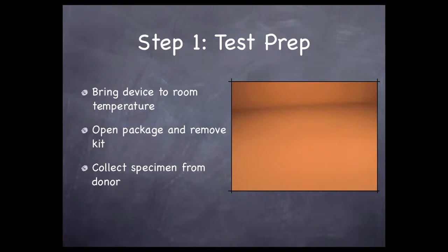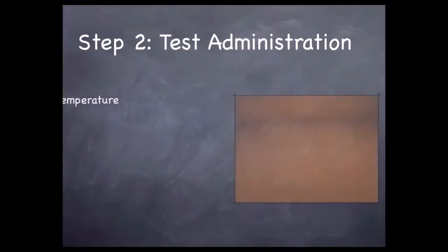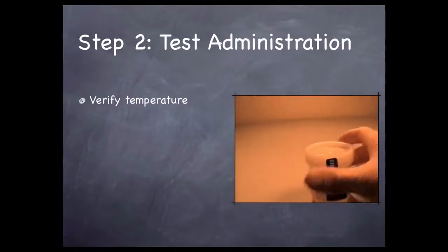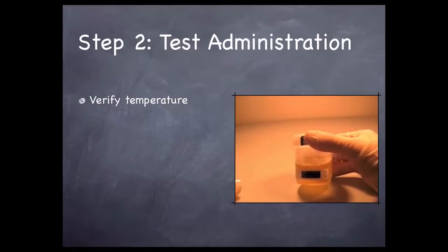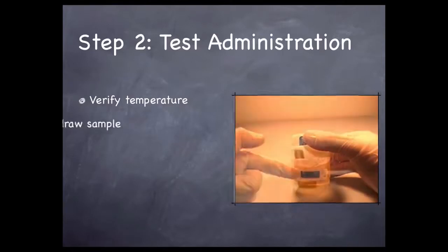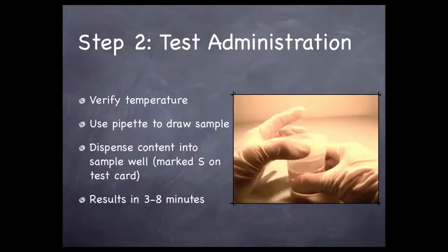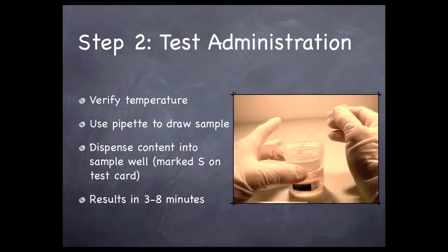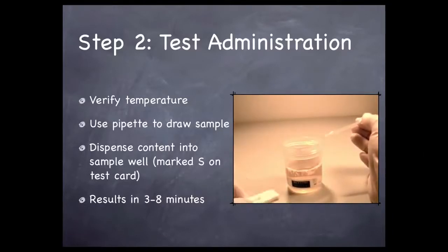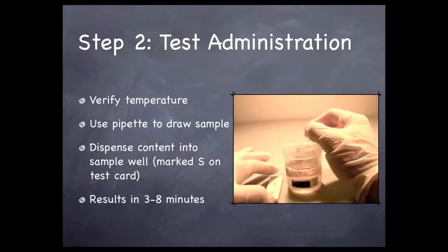Step 2. Test administration. Verify the temperature strip on the front of the collection cup to ensure a fresh sample. Next, use the pipette to draw the urine sample you collected from your teen from the cup we provided. You should draw to the line marked on the pipette. Dispense the entire contents from the pipette, about 3 drops worth, into the sample well. It is marked S on the test card. If you are administering the test to several of your teens, be sure to use a separate pipette and device for each sample.